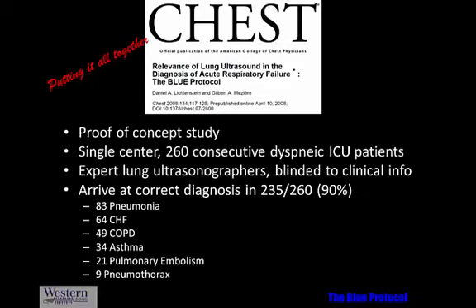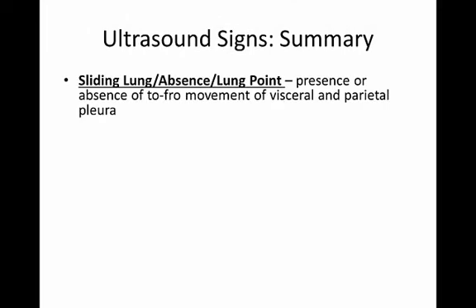If you want to put it all together, there's a great study that's a fabulous review of Lichtenstein's work done by him, applied at the bedside, blinded to those with respiratory failure, and shows how he's able to use these lung signatures that you've just heard me drone on about in real-time fashion, and to use them to very accurately pigeonhole patients who are on ventilators into the actual cause of their respiratory failure, just using these lung signatures. So it's a great study, and I would encourage you to check it out.